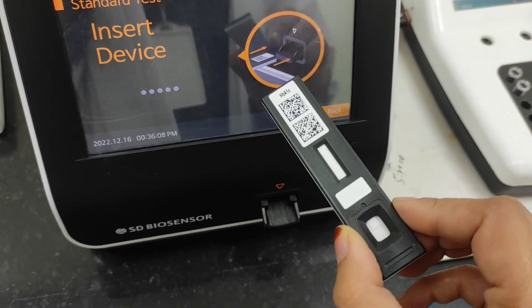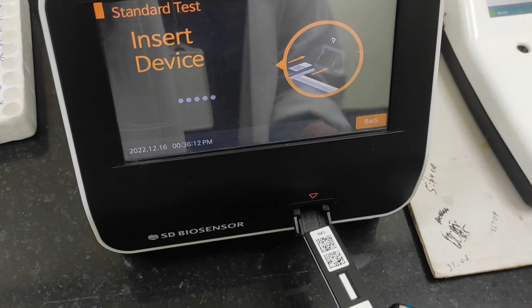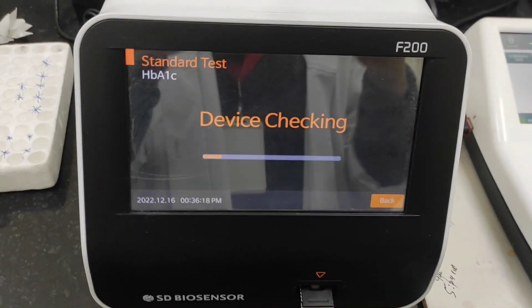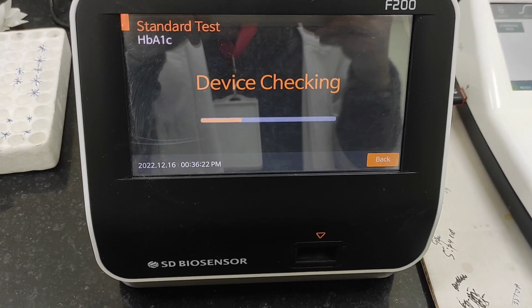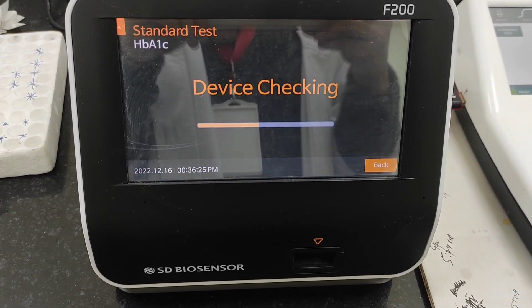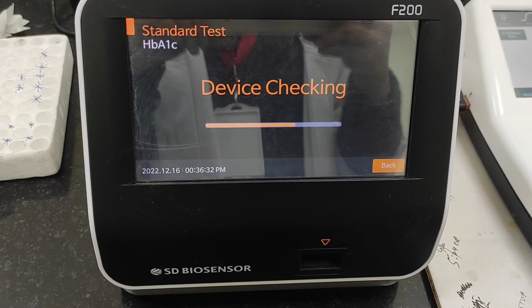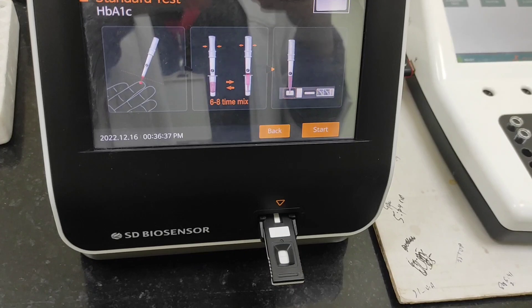We have to insert the card. As I said in my previous video, it will read the barcode and automatically tell about the testing procedure itself. Here you can see on the display that device checking is going on, and now it's complete.